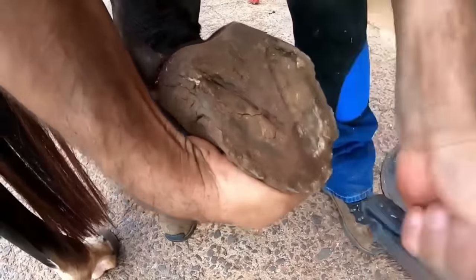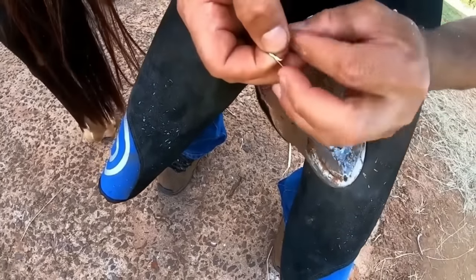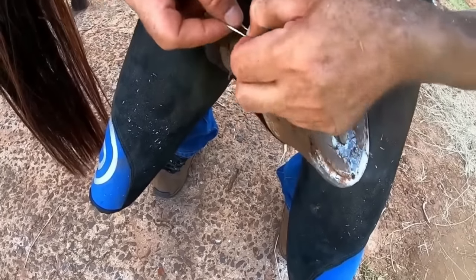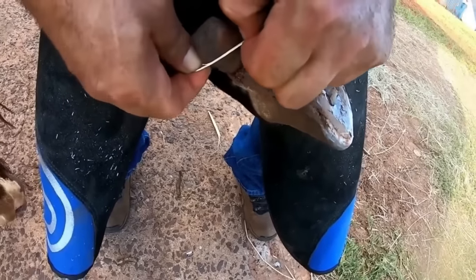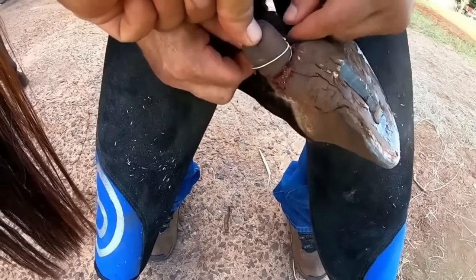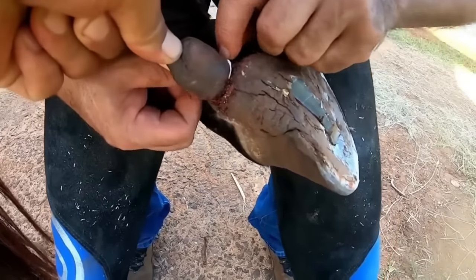And this will be the procedure. The procedure we are going to use here — because it is a small part of the hoof, as we were commenting — the intention is that it just holds the blood circulation in a simple way. There is also a surgical way, but this one is the simplest and also extremely effective. It holds and cuts part of the circulation.